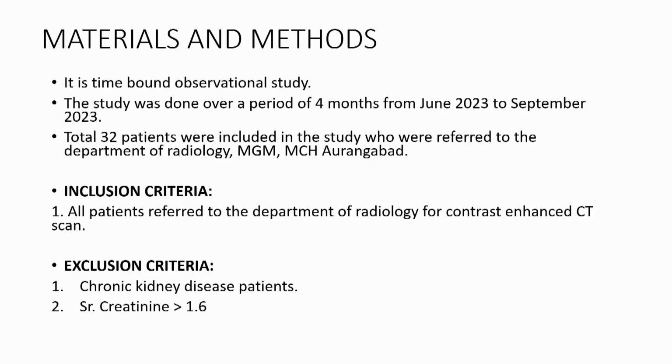It was a time-bound observational study which was run over a period of 4 months from June 2023 to September 2023. A total of 32 patients were included in the study who were referred to the Department of Radiology, MGM Aurangabad. All patients referred to the Department of Radiology for contrast CT scan were included in the study, and chronic kidney disease patients and patients with serum creatinine more than 1.6 were excluded.